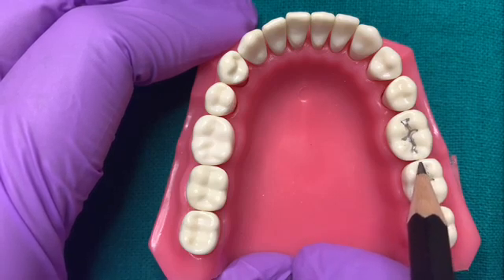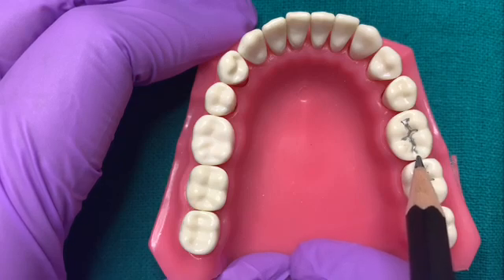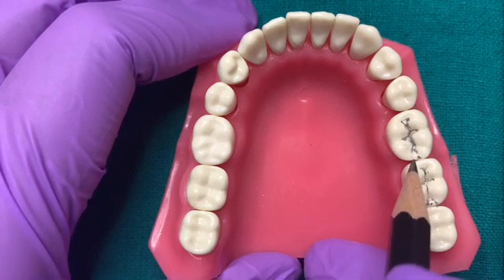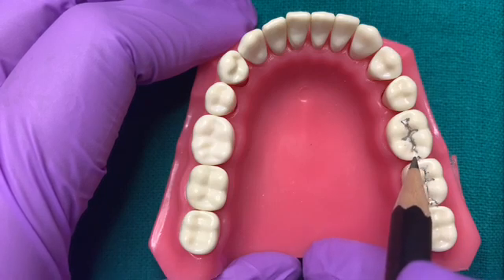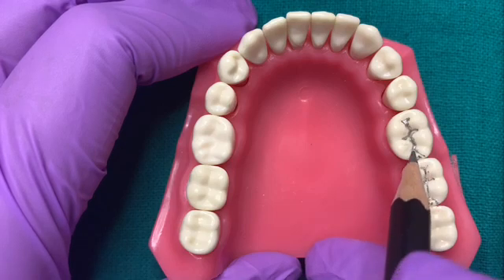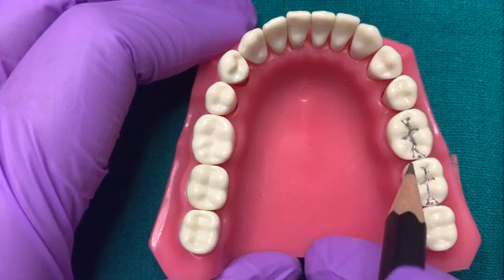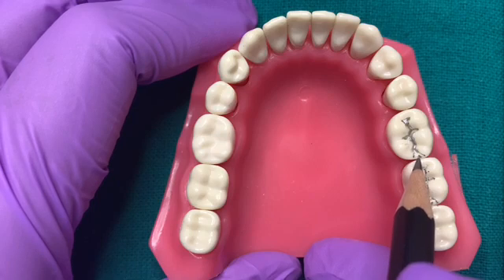Now the contact area is somewhere here. Our outline form on the proximal side should be such that we include this contact area. Buccally, we will have to proceed outwards like this, and lingually something like this. In this outline form for the proximal box, we have included the contact area completely.